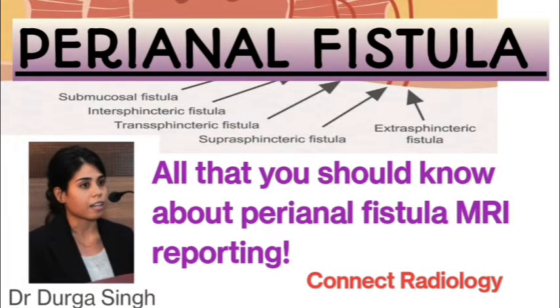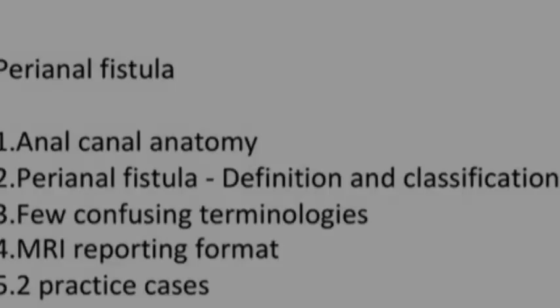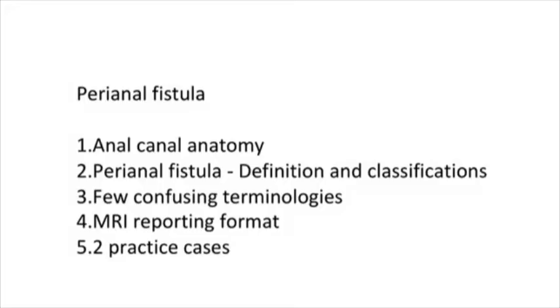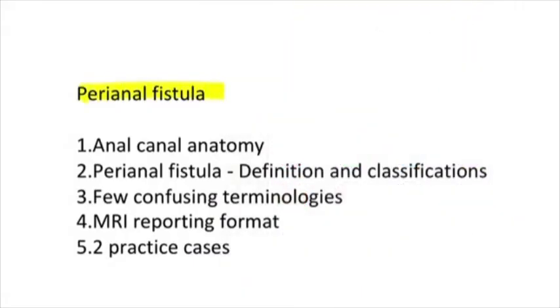So today's topic is an important and interesting one, and that's perianal fistula. In this video we are going to discuss the basic anatomy of the anal canal. Then we will discuss the definitions of fistulas and sinuses, and then the classification of the perianal fistula.